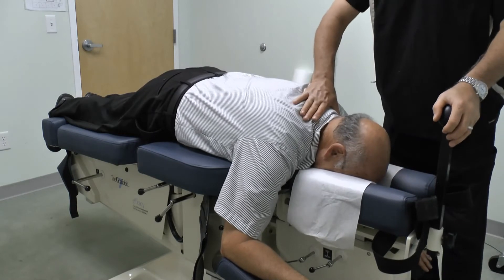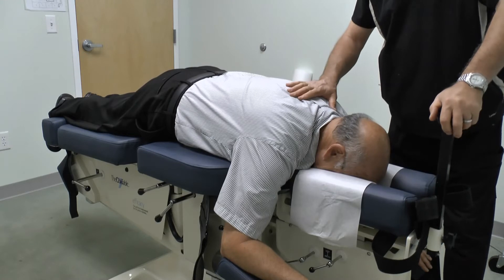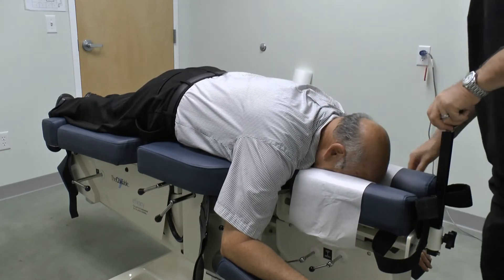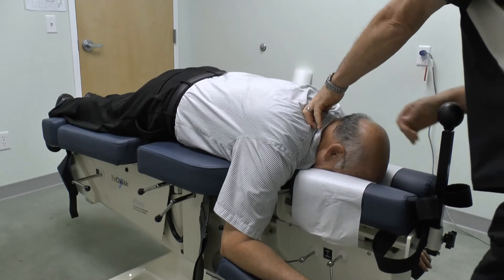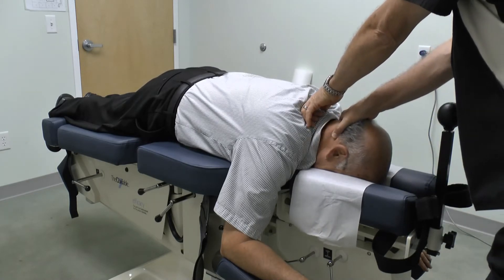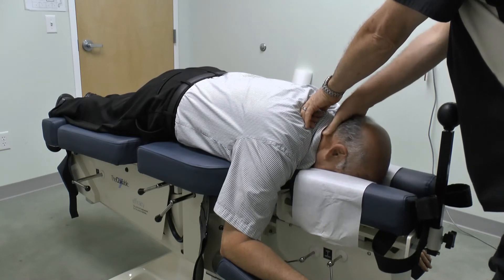Next we'll do protocol two on the upper thoracic spine without using the cervical and head straps. The first movement will be long y-axis. Since we're not using a strap we'll apply some contact to the occiput.